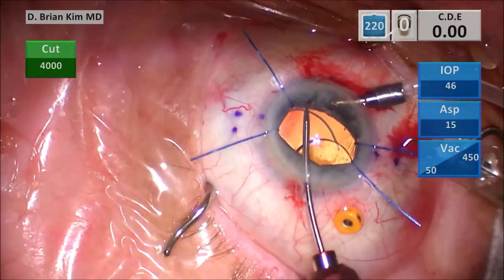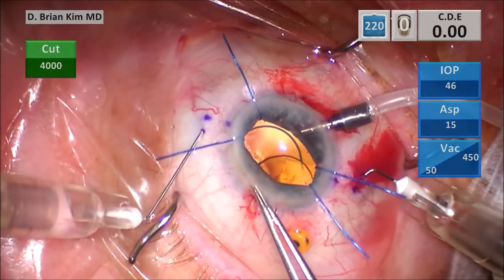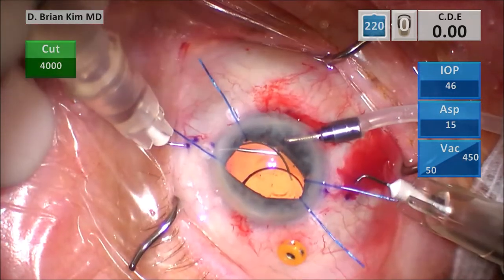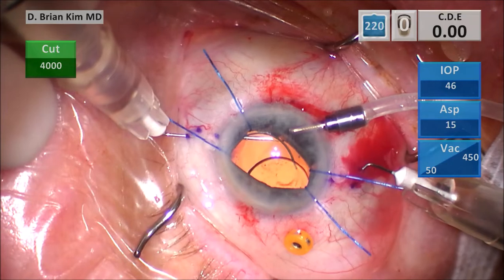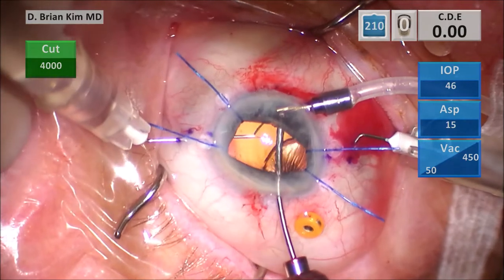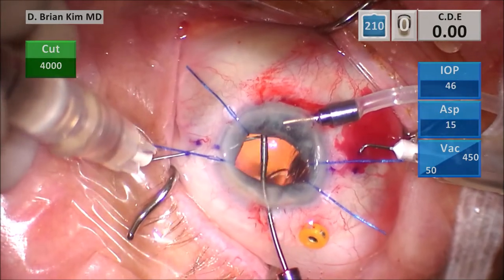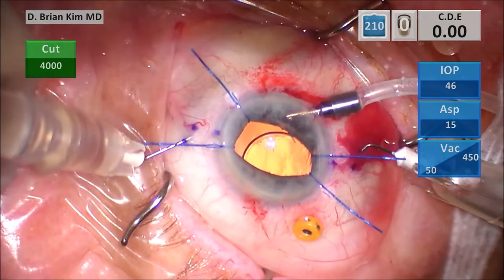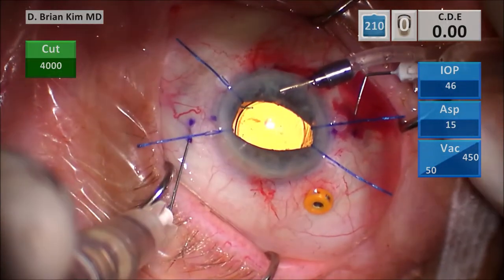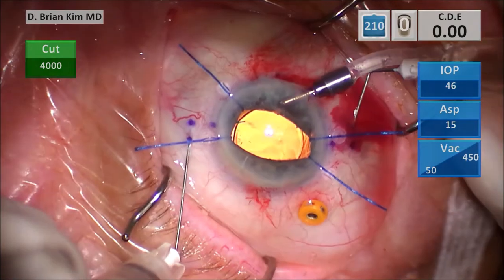Since I have this mounted on the syringe, I'm disengaging the needle from the syringe with the hemostat, then internalizing the leading haptic with micro forceps. You can see because I used the iris retractors how easy the visibility is — holding the incision with my right hand, tunneling with my left hand with the needle through the sclera 2 millimeters, dive down in the same plane, and then once I pierce through I rotate only after I pierce through. Grabbing the haptic, flattening it out on the bevel, making sure it's nice and parallel and straight.